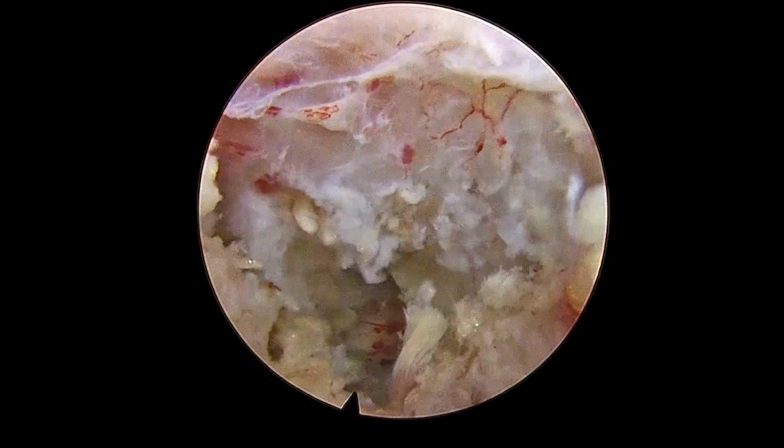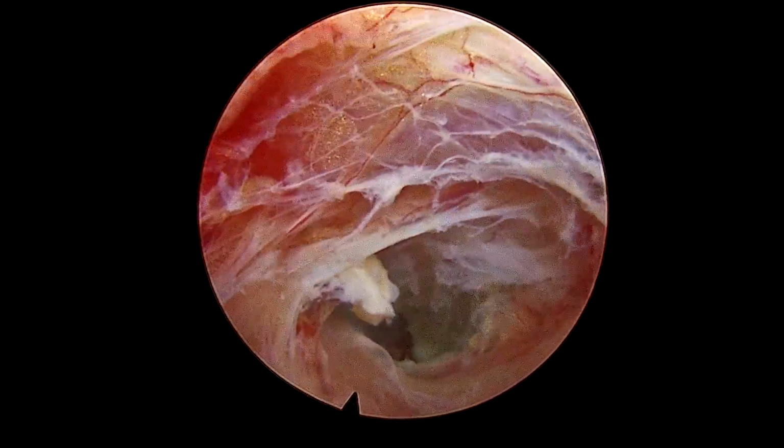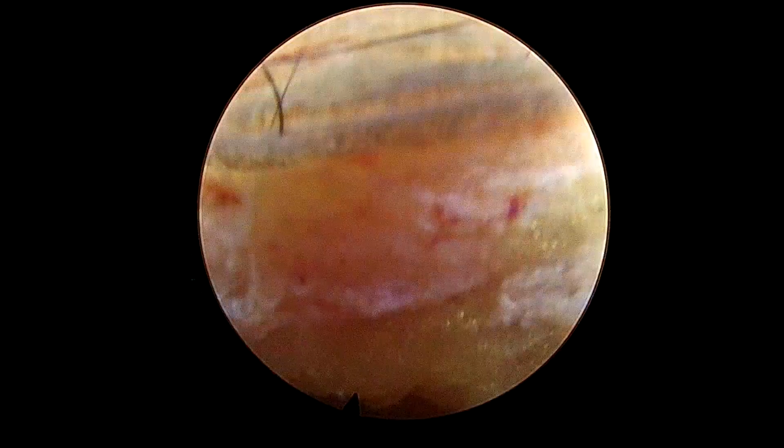Here is the beauty of endoscopic spine surgery. You can see here, once we remove the working sleeve, all the tissues like muscles and fascia just fall back to their normal position. And this is the end of the surgery here.